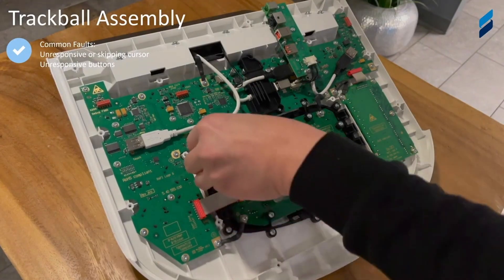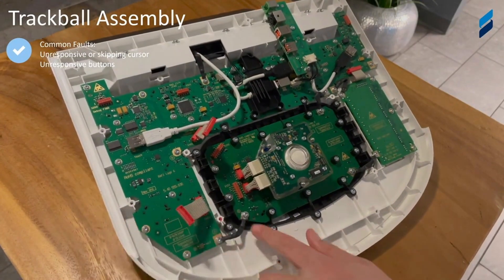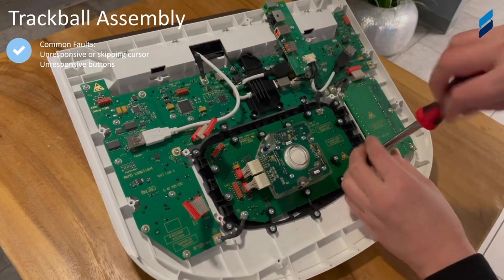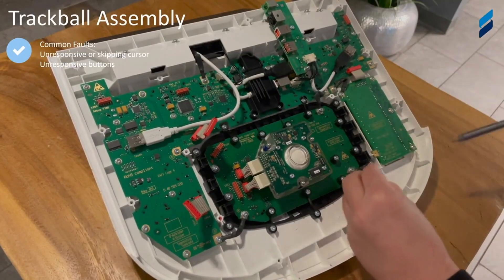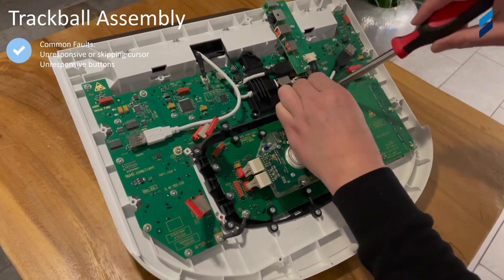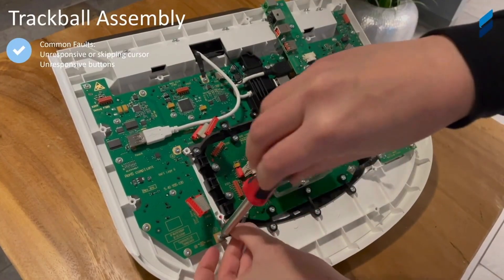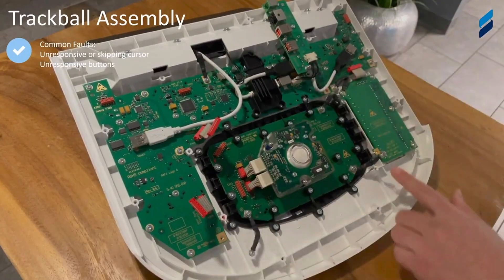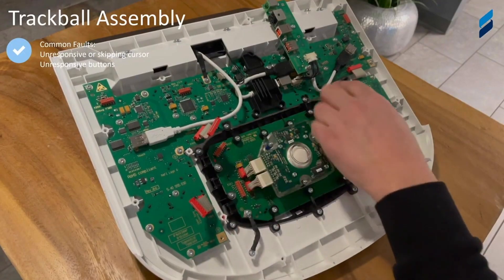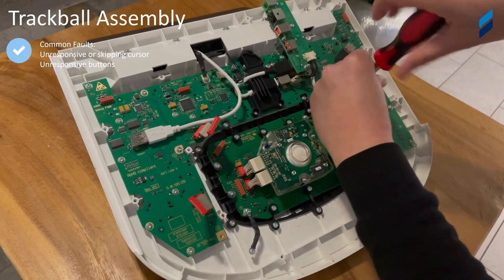Here we're going to show you how to remove the trackball assembly. Obviously the control panel is off. We're removing these two ribbon cables and a lot of screws that we're pointing out here. We're going to remove those so that the entire trackball assembly and buttons can be removed — because sometimes those buttons get sticky and stop working, or the trackball is skipping even after cleaning. Some gel may get in there. Just be careful in this area, as the plastic can be brittle at times.